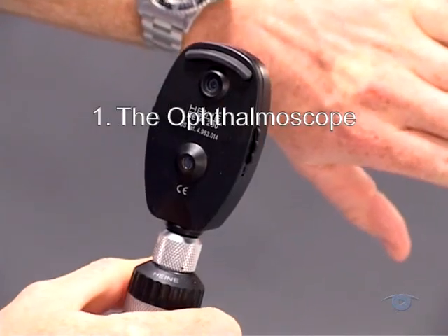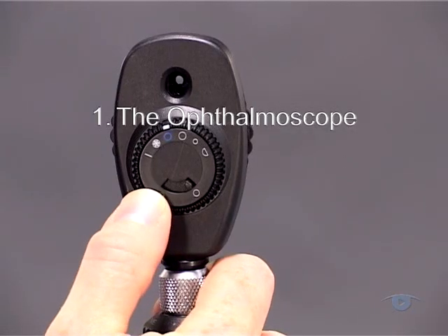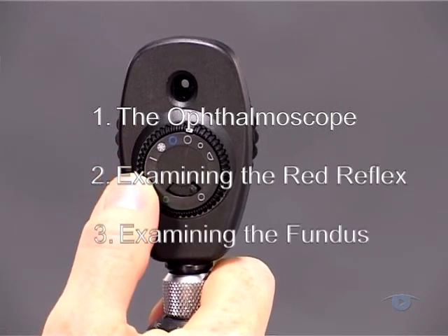You should now have a clear idea of how the instrument works and how to use the three controls. Let's move on to see how to use the ophthalmoscope for examining the red reflex and then the ocular fundus.